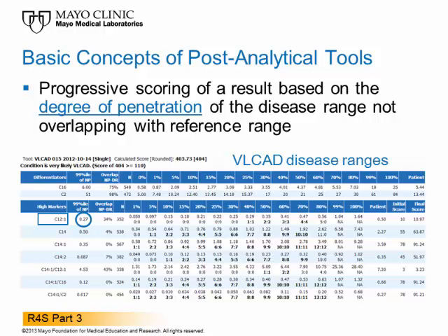As the degree of overlap between reference and disease range is equal to 34%, our result of 0.5 will not generate a score until it exceeds the 30th percentile of a disease range, which is 0.25 nanomole per ml. From that point on, the crossing of each percentile threshold that is lower than the patient value of 0.5 does generate a score.